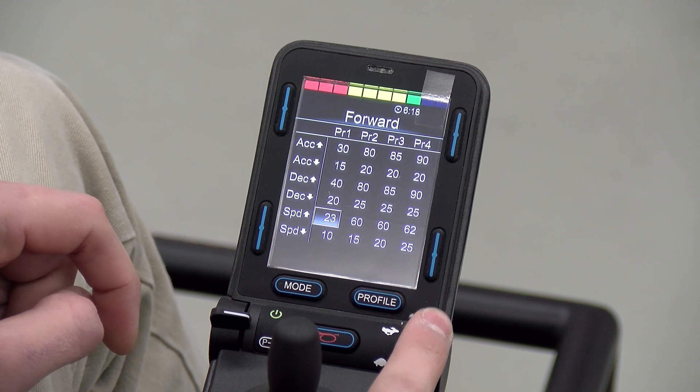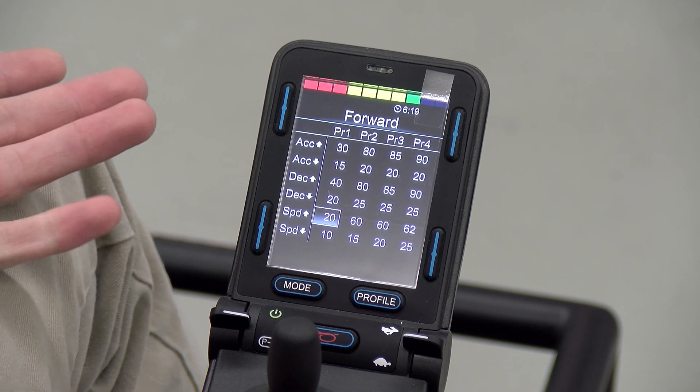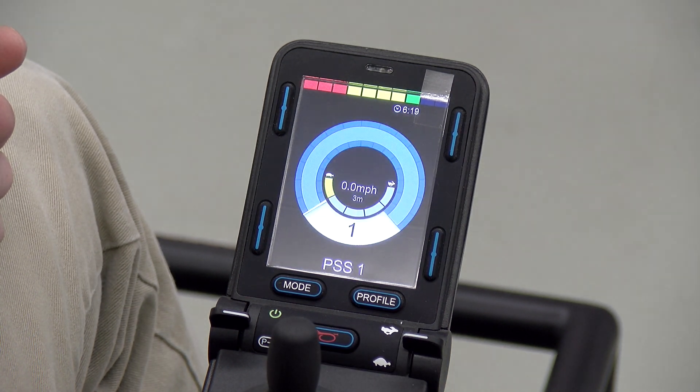When doing this, make sure to only change one setting at a time so you can remember which one it was, just in case you need to go back and change it if you don't like it. To get out of the onboard programming menu, you can repeatedly press left on the joystick or you can turn the joystick off and on again.